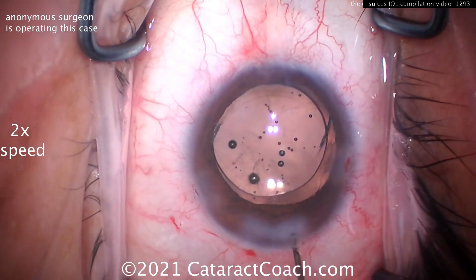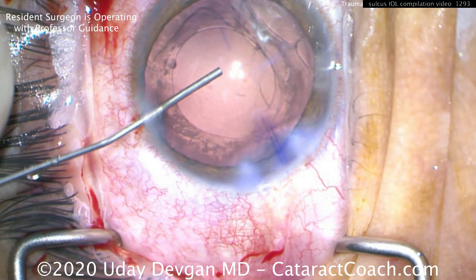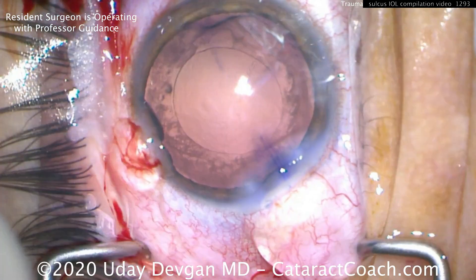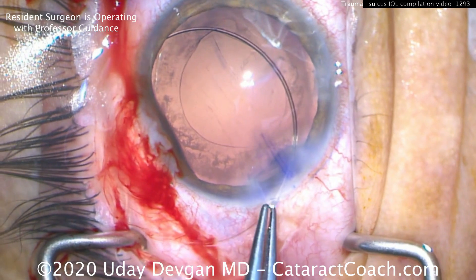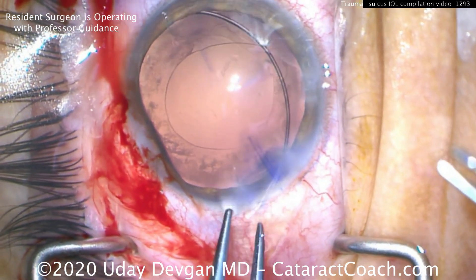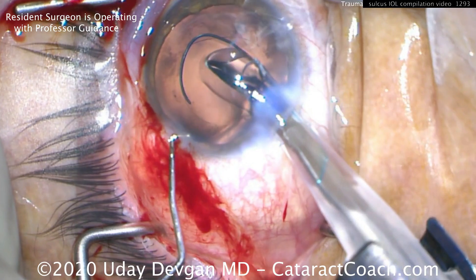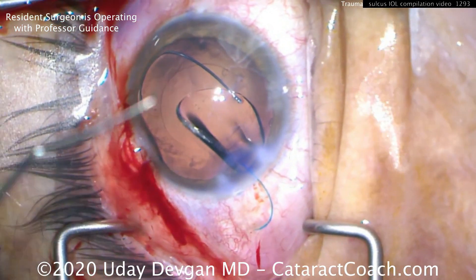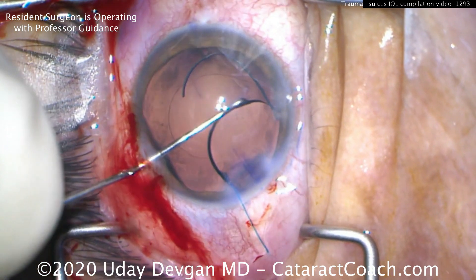Here's another case — look carefully, there's significant zonular dehiscence. The posterior capsule is intact, but there is a lot of zonular dehiscence from this traumatic cataract. First, let's place a capsular tension ring (CTR) in the eye. This is a resident operating — take your time. Getting that CTR in the capsular bag will provide a lot more support. You could place a single-piece acrylic or three-piece lens in the bag, but even more support and long-term stability comes from a three-piece IOL with haptics in the sulcus in anti-S orientation.